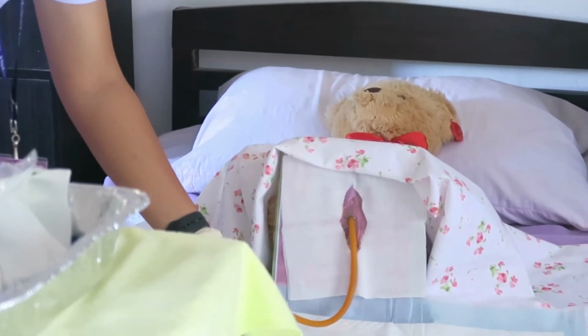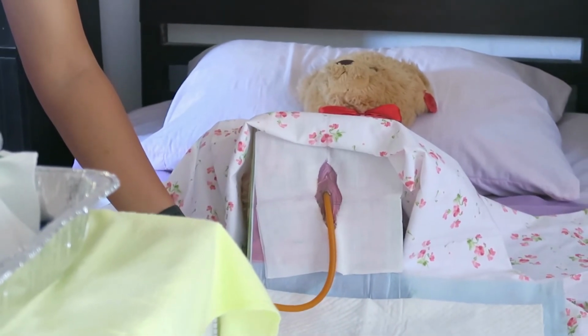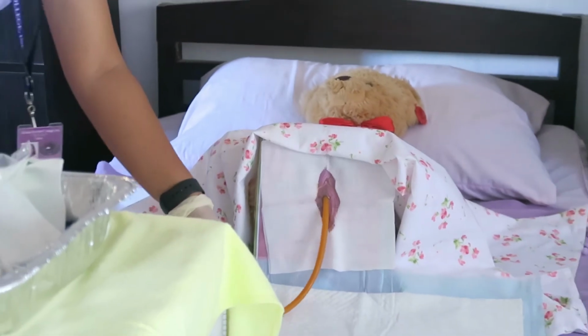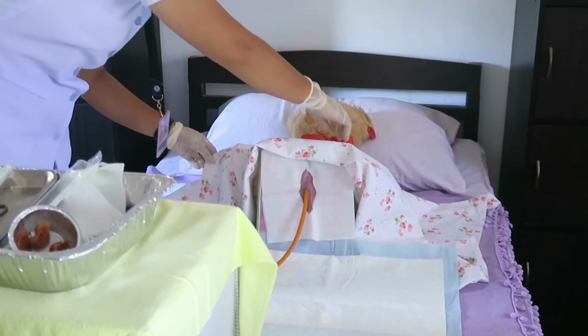Then after that, place the patient comfortably by positioning and covering to provide warmth and promote comfort. So ma'am, are you comfortable with your position po? Okay, so ma'am, I will cover ma'am ha.